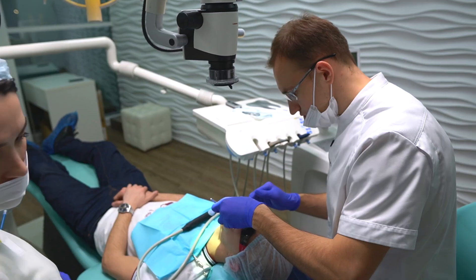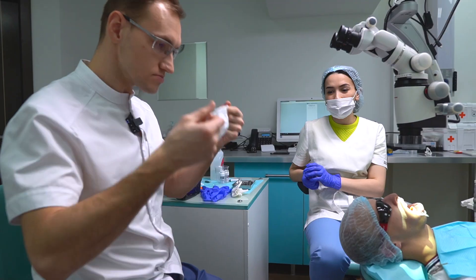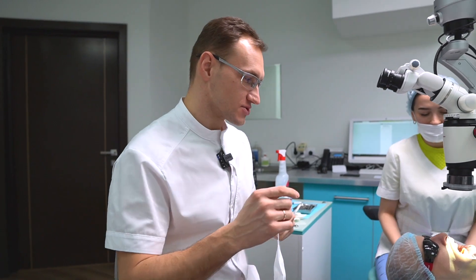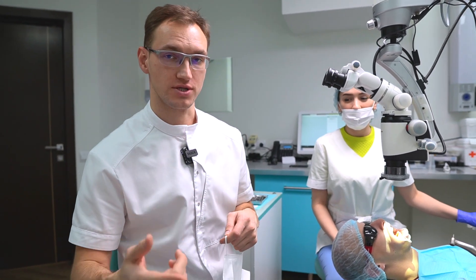Our tooth is ready and our scanner is also ready. Now I'm beginning to scan, and then I will create a new restoration in 3D.